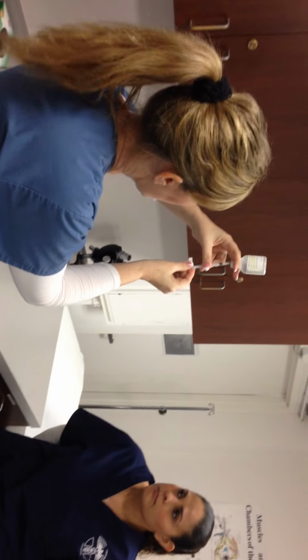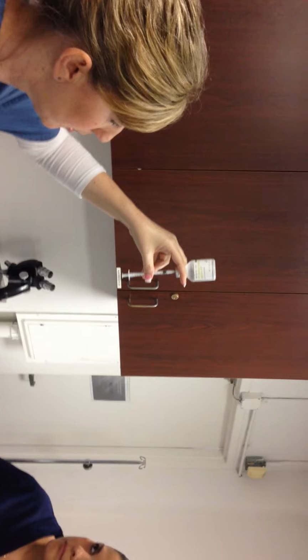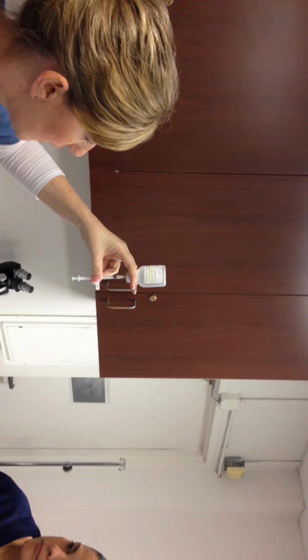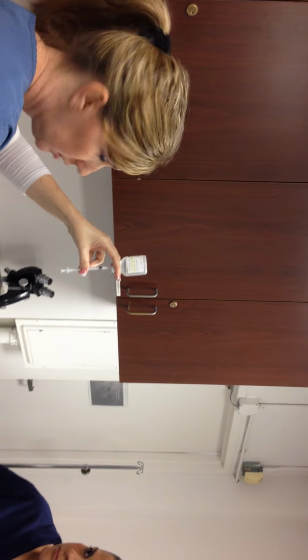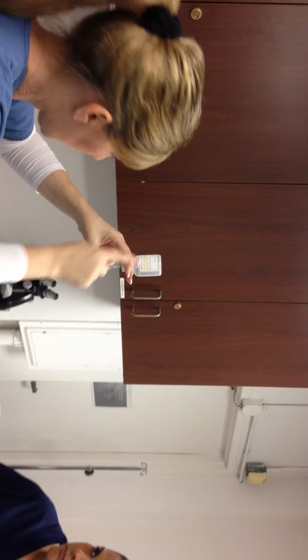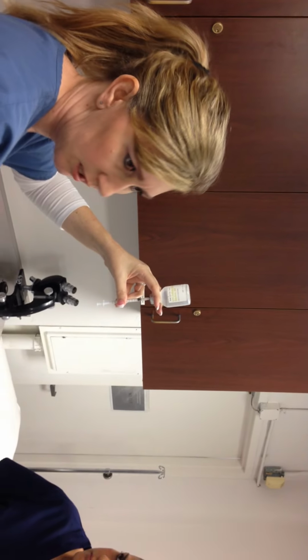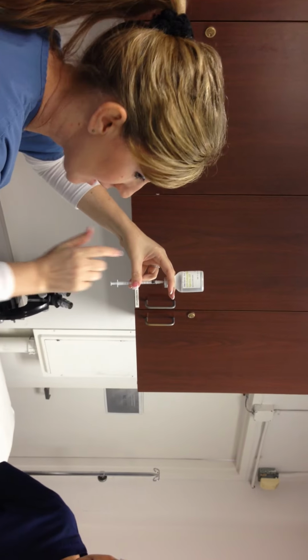Okay? So now I'm going to look and see what I'm doing. Okay, let's see here. And I'm right-handed, so I'm going to hold this with my left hand just like this. You're all going to do the same thing, and I'm going to walk around and help you. And I've already pushed the air in. And here we go. I'm checking again. Yep, such and such patient. I'm checking here on my chart. Yep, such and such medication. That's what the doctor ordered. I'm checking again and again and again, right? We already pushed the air in, air to air.